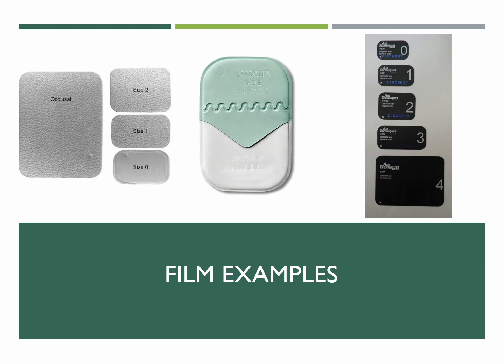Now, they don't have a dot, but what they have is an A. And it's really important, first of all, that you put the right side of the film towards the tube head, just like an X-ray cassette. And also to make sure that the A is at the front of the mouth so that we can locate. That's just kind of a standard language that we do. And again, we have every size from 0 to 4. Once you take the X-ray, you run it through the processing machine, it comes up with the image, and it also wipes off that image so that you can take another one for the next shot.